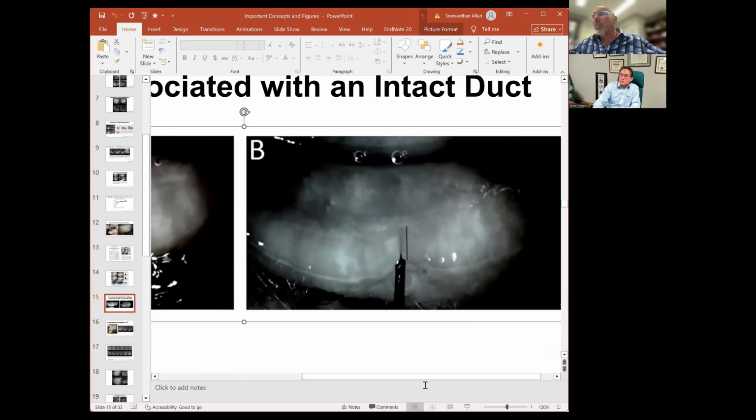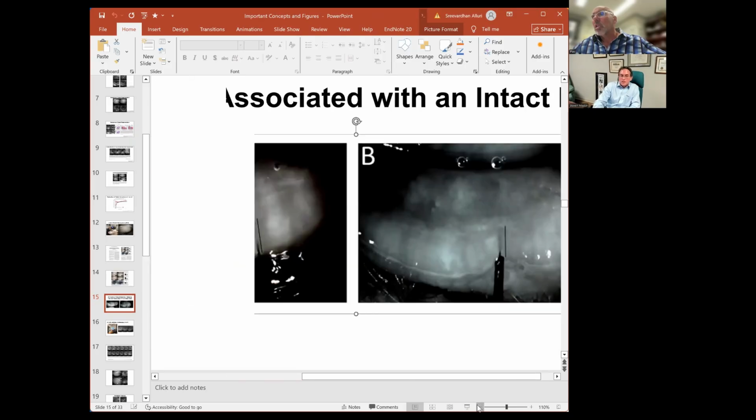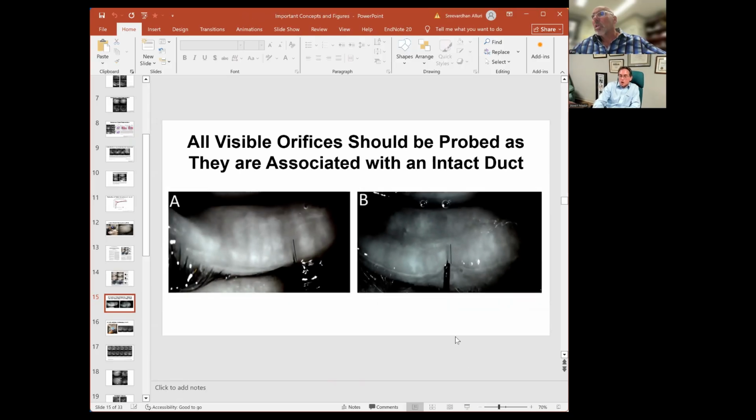Would you find the same with Accutane users? Well, Accutane will cause involution of the meibomian glands, so you could get to a point like this. Because it's a systemic medication, it typically affects all the glands similarly. In this case, you can see the variability from gland to gland. So this would not likely be an Accutane case, but the response is the same, meaning Accutane patients do very well with the approach we've outlined tonight. Very well, that's great.